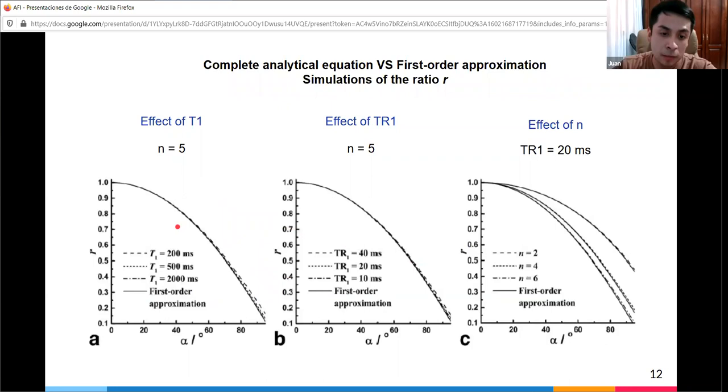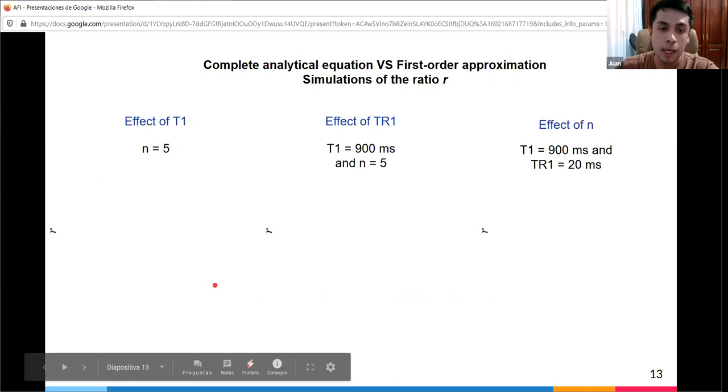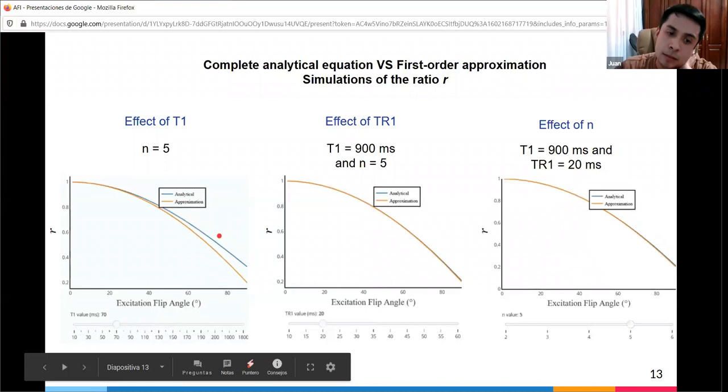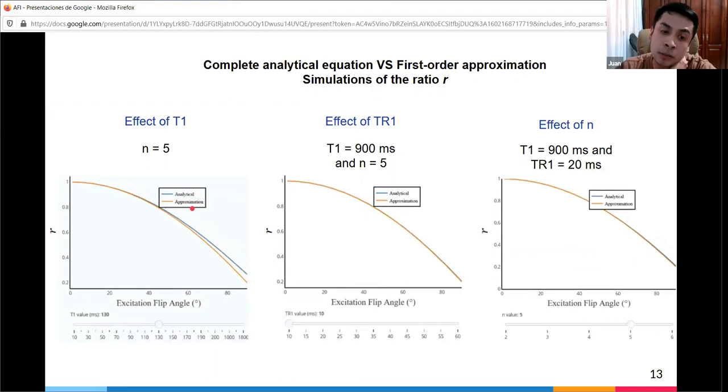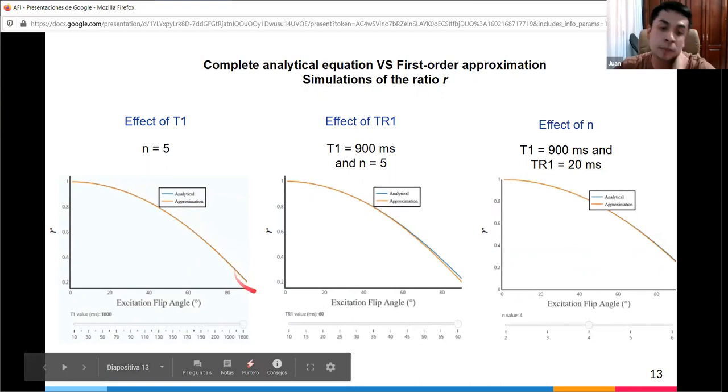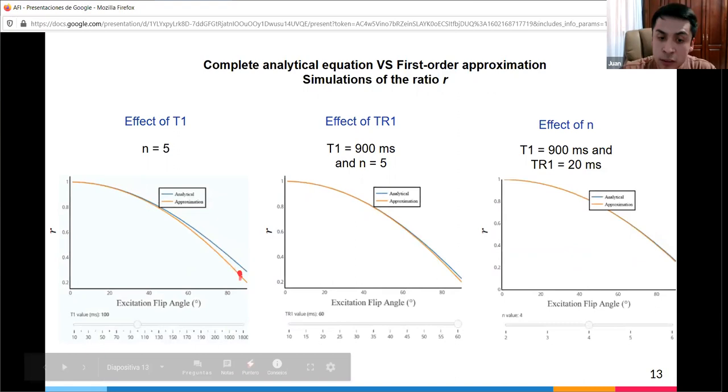These are the plots from the original paper. They made them interactive to show more than 3 T1 values. Here the user can change the relaxation time T1 value. Notice large differences between the analytical (blue) and approximation (orange). These differences are more pronounced for short T1 values and high excitation flip angles. AFI is considered T1 insensitive to a wide range of T1 values because after 200 milliseconds, there's only slight deviation at high excitation flip angles.